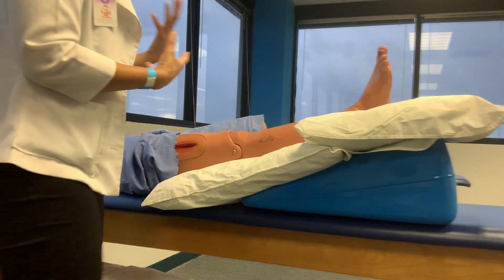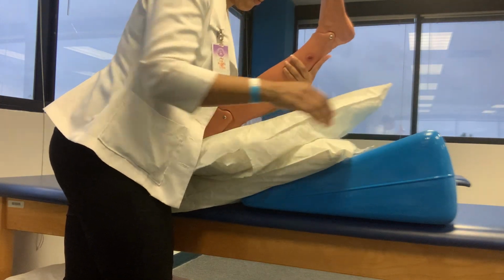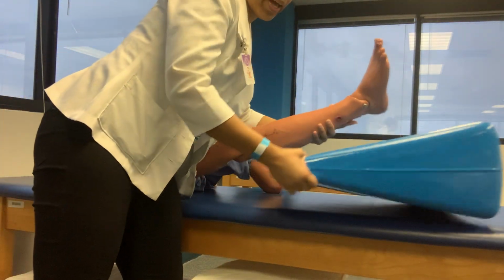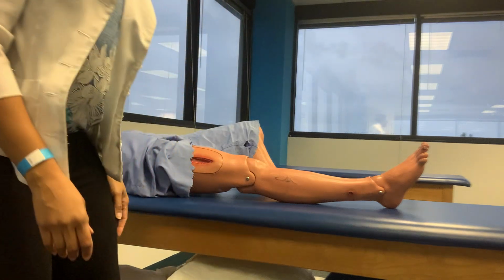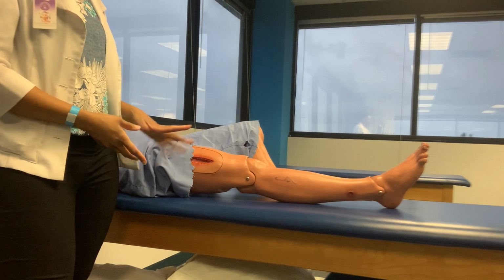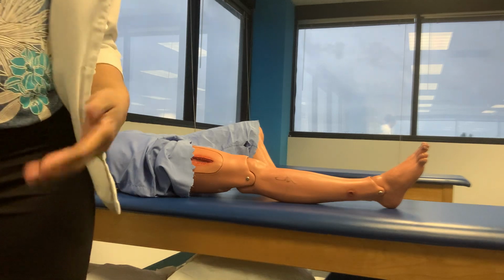So once you've done all of that, you've checked them and the patient's doing okay, we'll go ahead and we'll remove the pillows. We'll remove the wedge. And then you assist your patient to sit up, put their shoes on, and leave. And then that would be the application of your intermittent compression. And the end of your skills check.